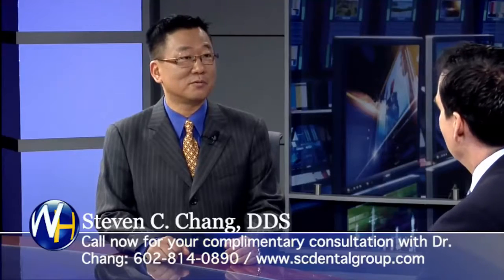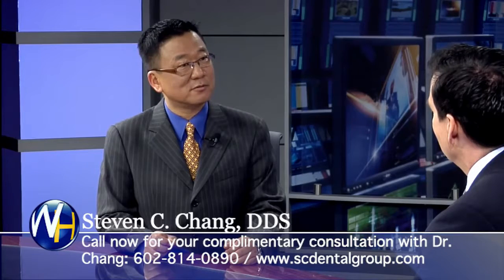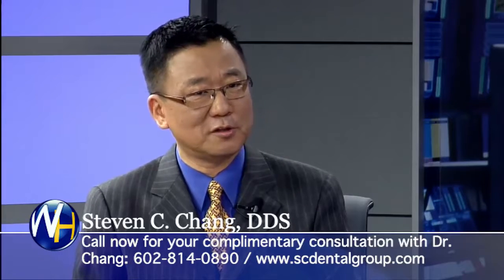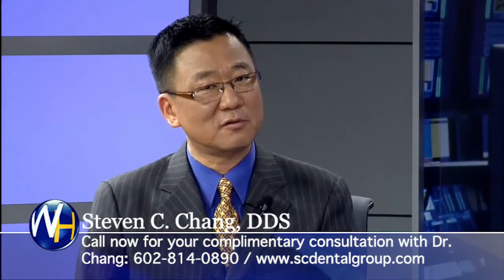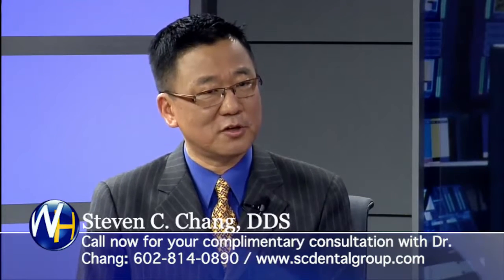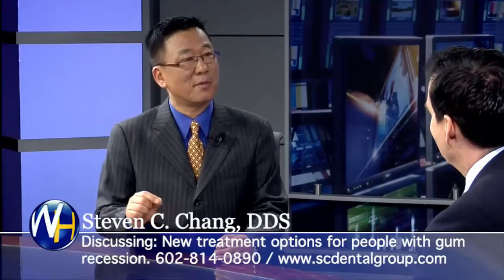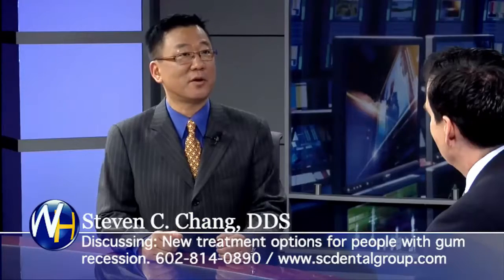Okay, but why do you call it a pinhole technique? Instead of using a scalpel or incision, we use a very small needle, about 1/10 of an inch, to penetrate. We usually go two teeth away from the affected area, behind or in front, so we go distal of two teeth behind or two teeth in front. That way we can insert the instruments to detach the tissue and manipulate it down, using a special strip of membrane to hold it down. So it stays down. Stays down, and it is very stable.